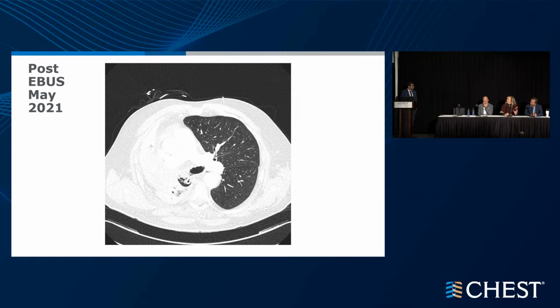And in the setting of the procedure, was there a debulk, any form of attempt to debulk? No, this is diagnostic purely to get a diagnosis. Okay, but you gave us an endoluminal view that showed complete obstruction, it appears, of essentially the proximal right main stem. Post-procedure, yeah. The tumor was initially coming from the right upper lobe and emanating from that. So now you've got complete obstruction, and maybe you've caused bleeding, and there's mucus and all the things that go along with the biopsy, which has led to complete whiteout of the right side, and really single lung ventilation is what's happening. Exactly. So you're asking me, what would I do next?